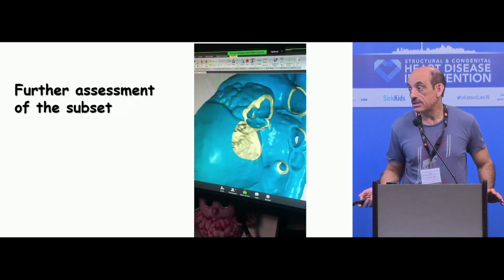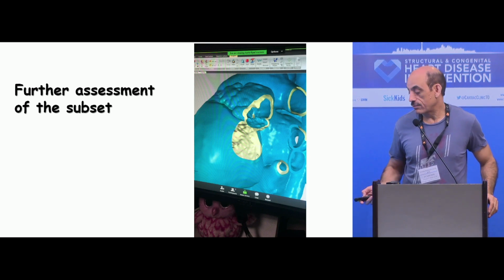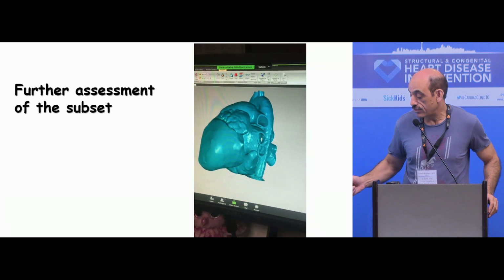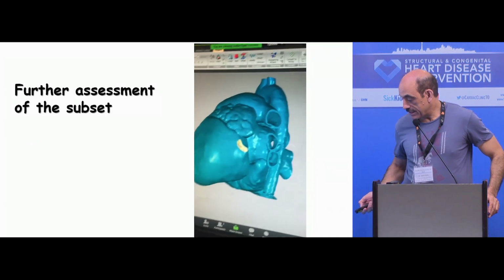So I sent this information to Steve Pofeld. He does 3D reconstruction with CT and transesophageal echo. Can you run this for me? It may take about 30 to 45 seconds, but you see how complicated the septum is. He goes from the left atrial side, and as he goes in, you will start seeing the septum.